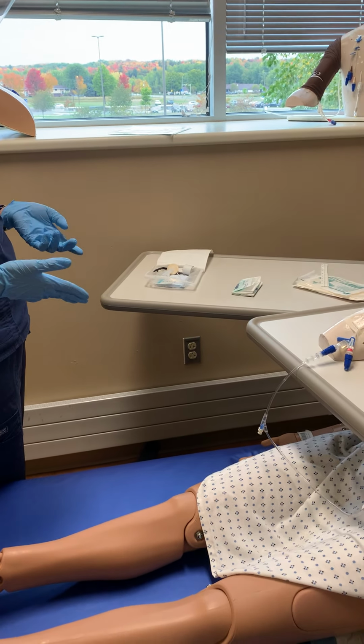So my next move is to remove this dressing. So I will wash my hands again. I'm already wearing a mask upon entering the room and the shield, but if I didn't already have the mask on, I would wash my hands, put on my mask, and wash my hands again, because I also have to be masked for this procedure. So I'm going to wash my hands, and I'm going to put on my clean gloves, and we're now going to remove this old dressing.